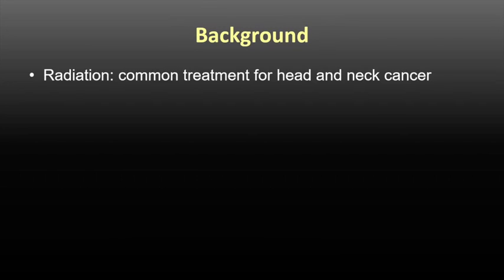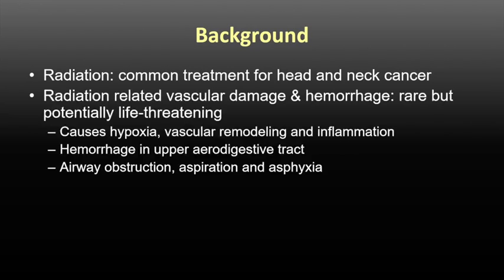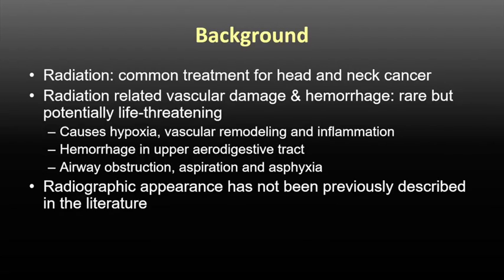Radiation is commonly used in treatment for head and neck cancer in combination with surgery and chemotherapy. Radiation is a great tool; however, it's not without its downfall. Radiation can cause vascular damage and hemorrhage, which could lead to life-threatening situations, especially when it presents in the aerodigestive tract. It is important for radiologists looking at this study to be aware of telltale signs and know where to look.